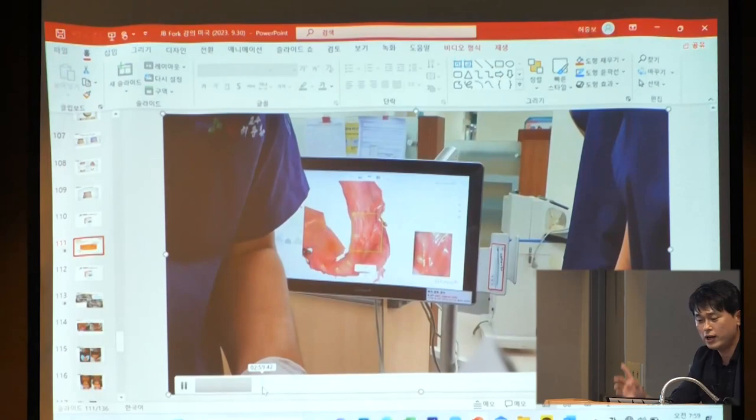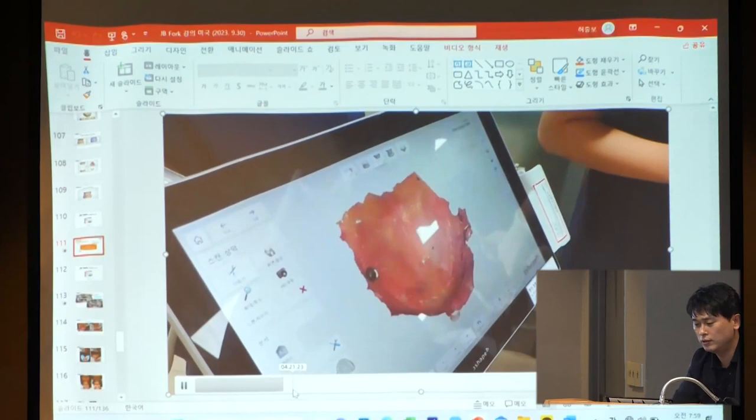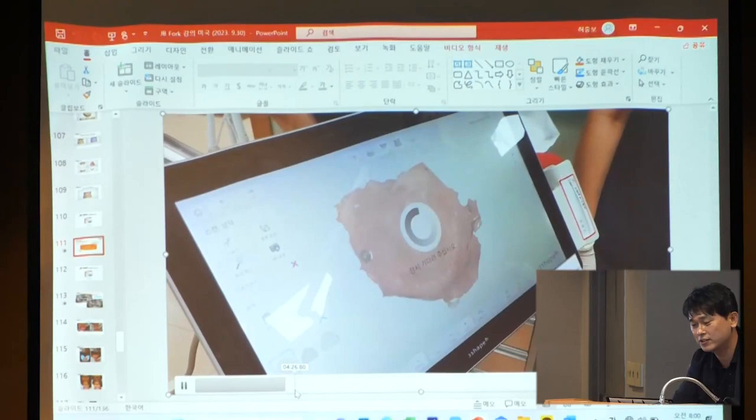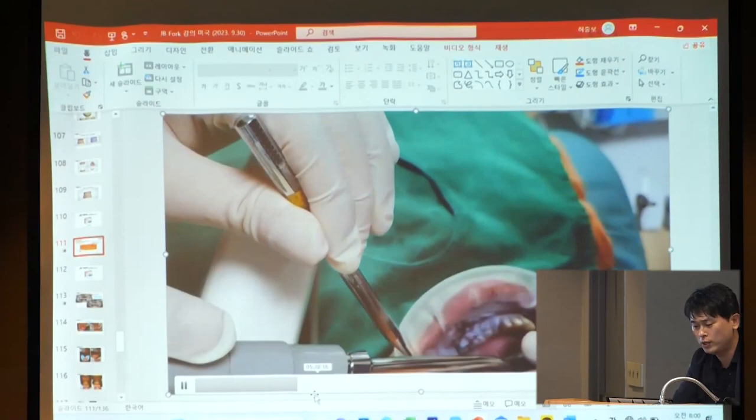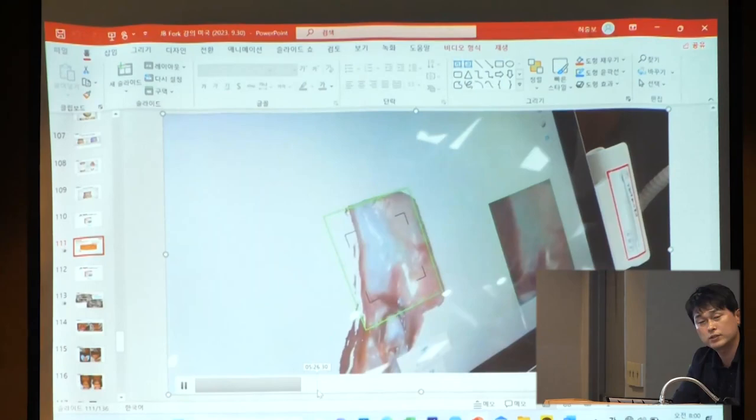Real-time scanning. Anyway, I can scan like this, the upper, and then I adjust the 2-layer or 3-layer scanned area, erase that part, and scan one more time. And in the case of the lower, the patient has residual remaining teeth, and then the extraction is scheduled. So I didn't make reference points, and I scanned directly like this.